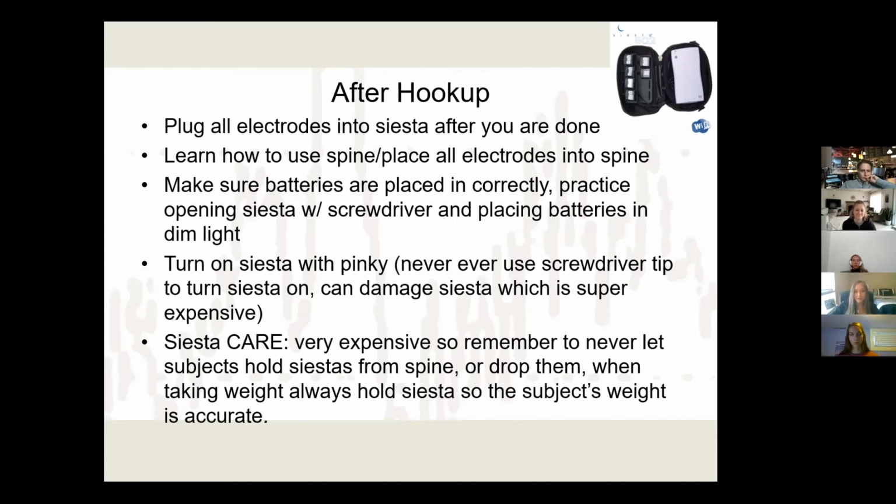But something we definitely want to remember is never use the screwdriver tip to try to turn it on. You might think, oh, this is small, I can just press it down. But in Boulder, we have had people use the screwdriver and then the button disappears into the siesta. And these devices are really expensive. So we just want to take care of them as best we can, both ourselves and by reminding participants to care for them, never holding the siesta by the wires or dropping it, stuff like that.